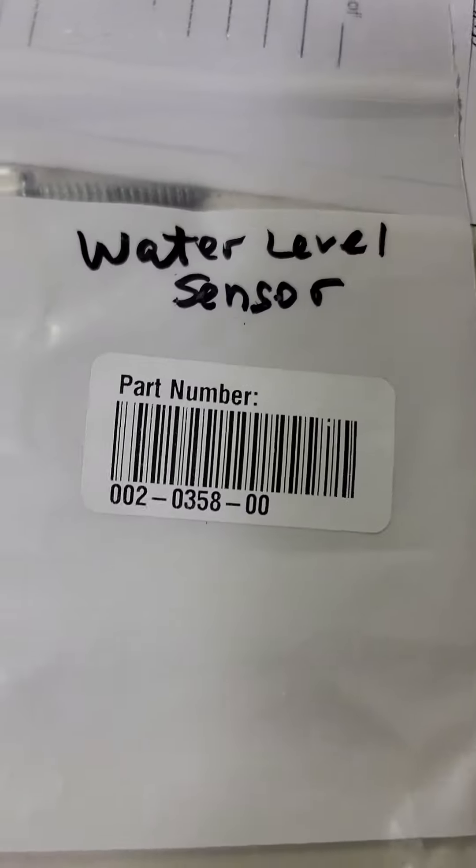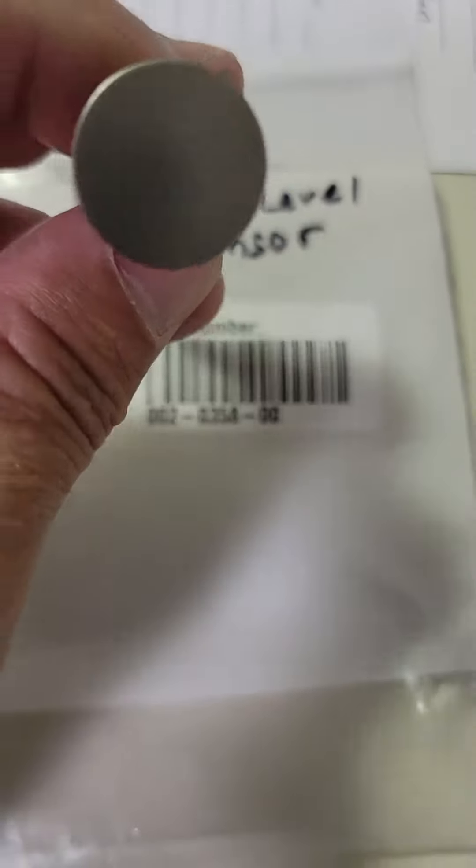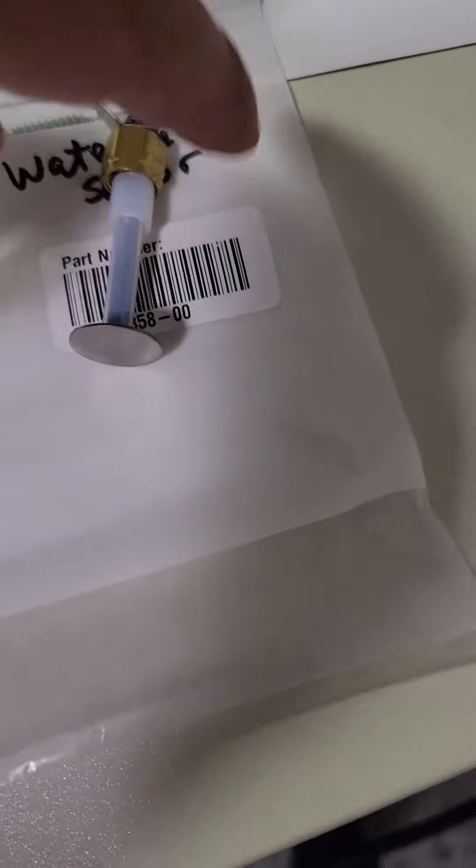Alright, mid-mark water level sensor. Water level sensor — there's your mid-mark part number, this is the water level sensor. You typically see it in the back of your mid-mark chamber: M9, M11, M7, all the same, M3, whatever.